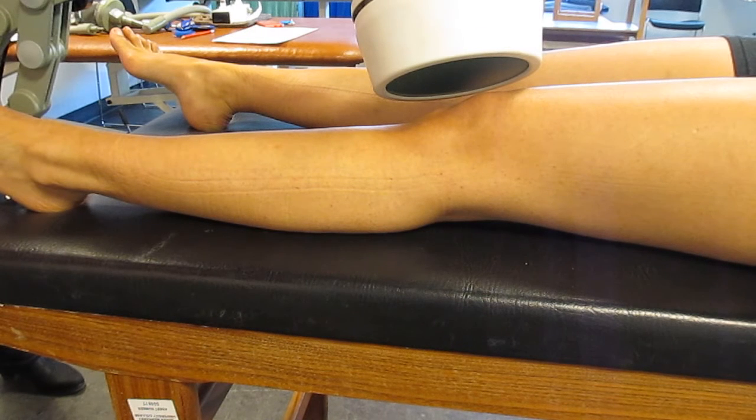Having instructed my patient that they shouldn't be feeling any heating, I'm then going to check them regularly throughout the 10 minutes, and they've got a buzzer to grab my attention if they need to when I'm not in the cubicle. Because for safety reasons, as a physiotherapist, once you've set the machine going, you should be at least half a metre to a metre away from the machine for the duration of its operation, just for your own health and safety.